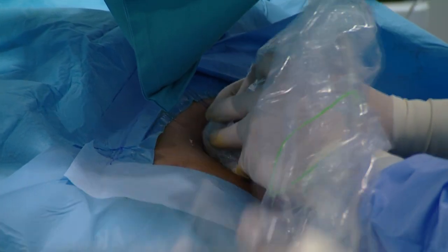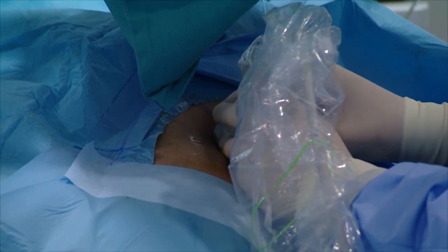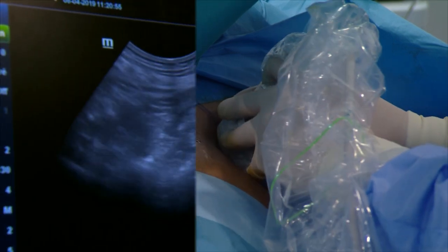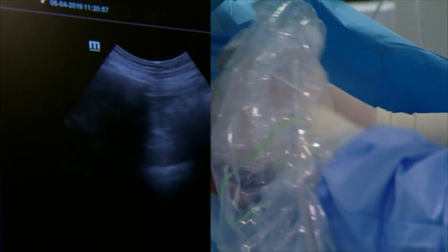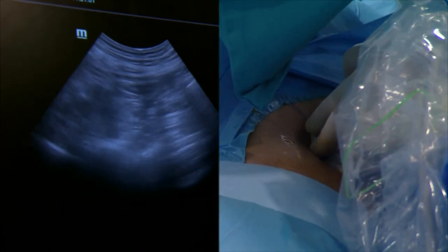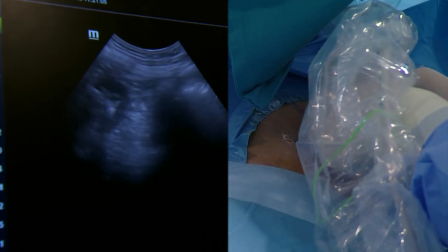This depends on the ultrasound probe. And because I'm not familiar with your ultrasound probe, I cannot give you the answer. I'm not sure. So you're looking for the needle. Yes, we see it now. Maybe you have to go a little bit deeper with your needle.